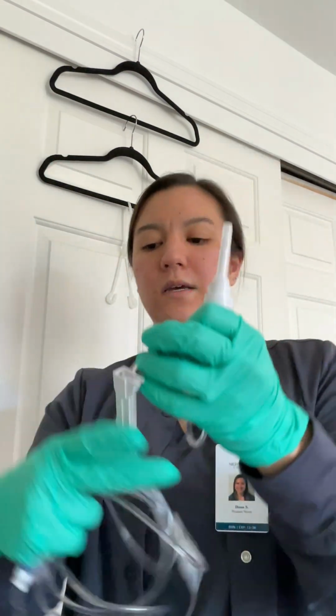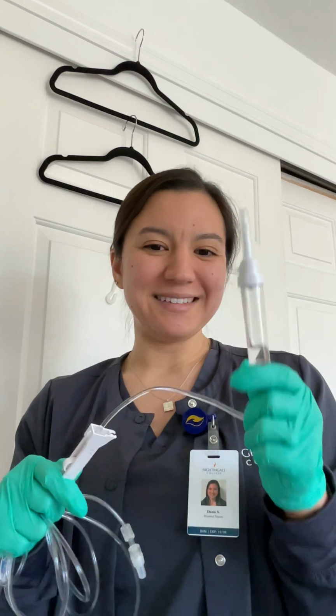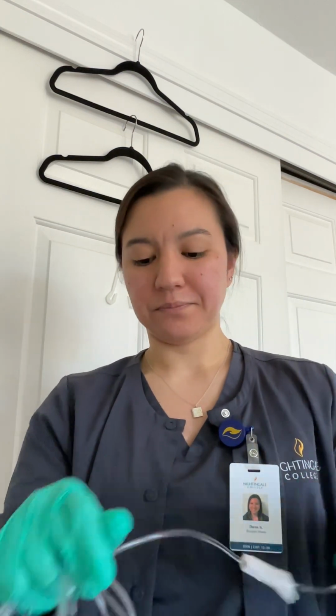Also, this is where the air is going to stay instead of going through the tube and into the patient. This is the clamp roller. This is where you're going to be controlling how many drops per minute you are inserting into the patient. So all the way down means you're not getting anything through this tube. All the way up means it's just going to free flow all the way down.